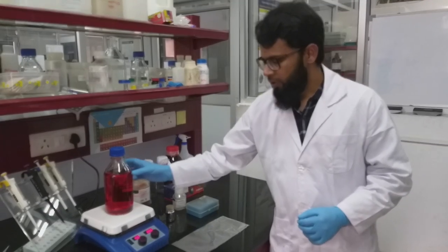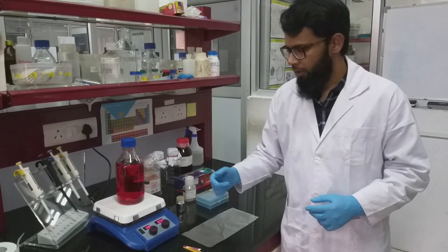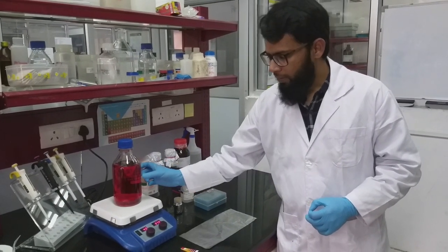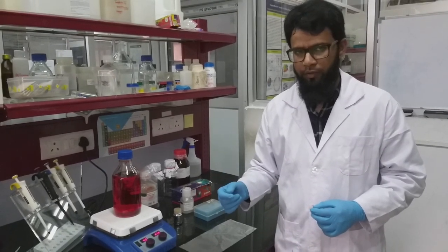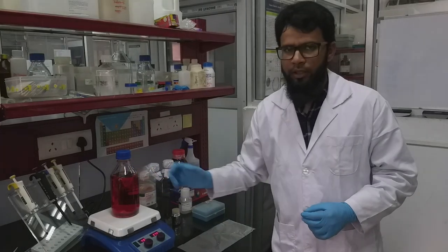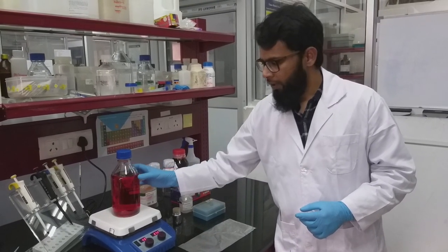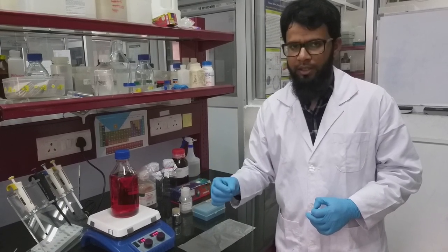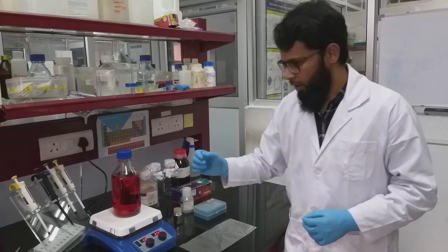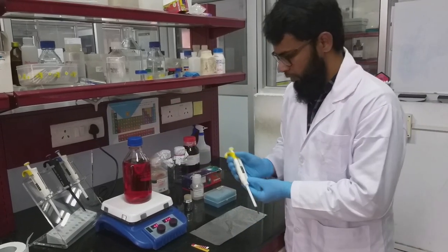After the components of the media have been dissolved completely, we now need to adjust the pH of the media. The bright red color indicates that the pH of the media is in the range of 7.2 to 7.4. If the color of the media turns purple, then it indicates that the media is basic. If the color of the media turns yellow, then it indicates that the media has become acidic. Now we will be checking whether our media falls in the range of 7.2 to 7.4.